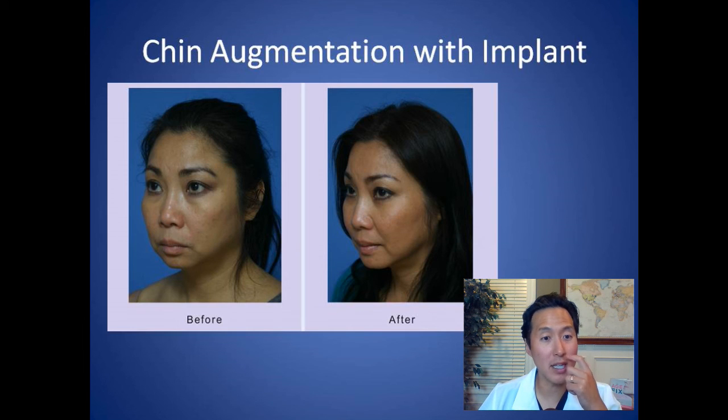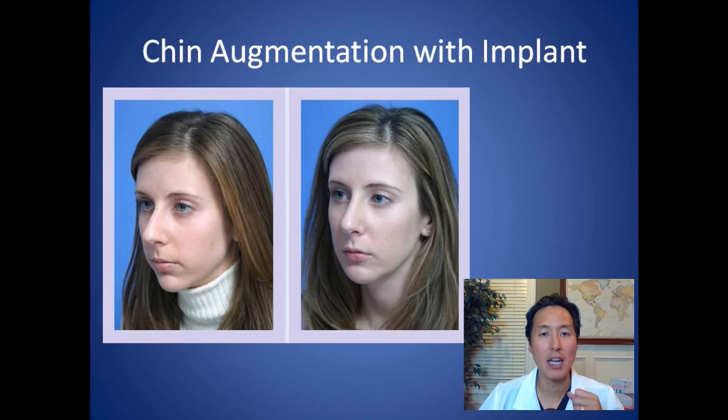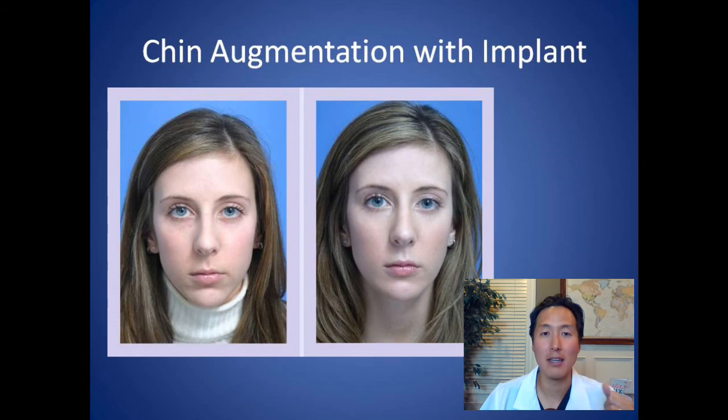Now, this next one will really give you that idea. So if you look at her before, on her left side, the chin's a bit small, and I did take a tiny bump off of her nose as well. But the big thing is if you look at her after picture, she looks more attractive there. She looks prettier, and it's because, and not that we did anything with her eyes or her lips, really the fact is putting that chin implant just gets better harmony to her face and actually makes her look more attractive.